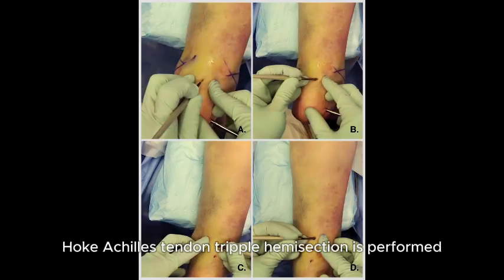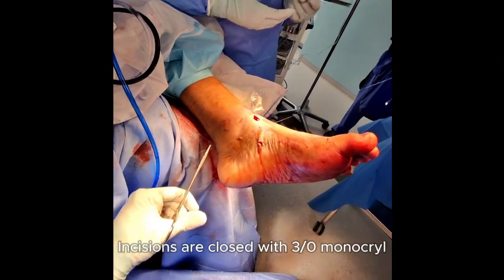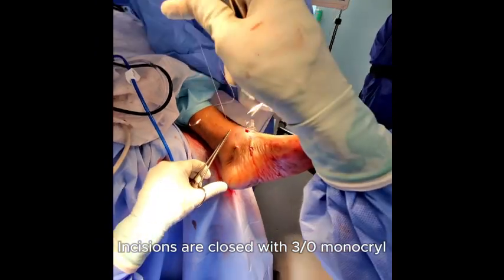Hoke Achilles tendon triple hemisection is performed. Incisions are closed with 3/0 Monocryl.